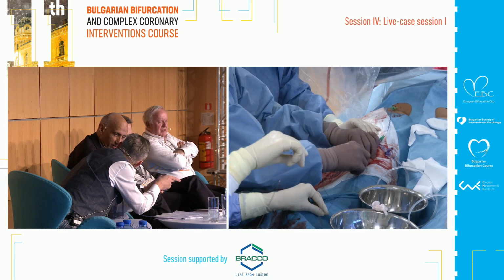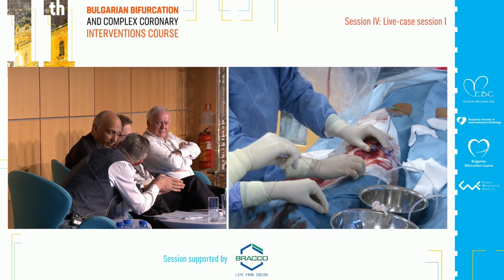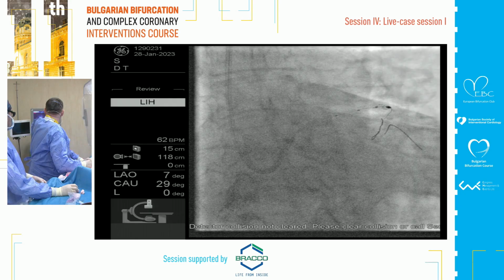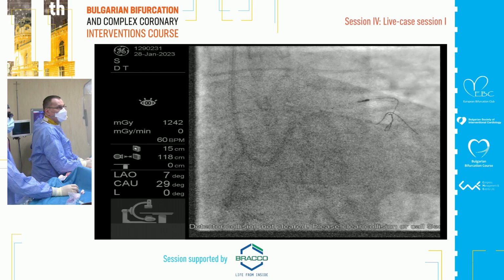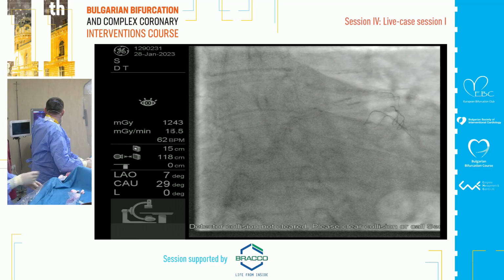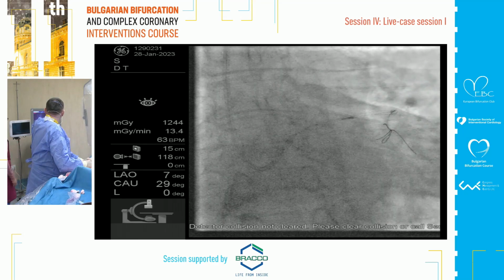We'll see the end of the procedure in the other room. 14 millimeters. Then 14, yes, it is. Yeah, it's very short. Have you finished? No, I'm finishing slowly. That's much better. Much better, yeah.